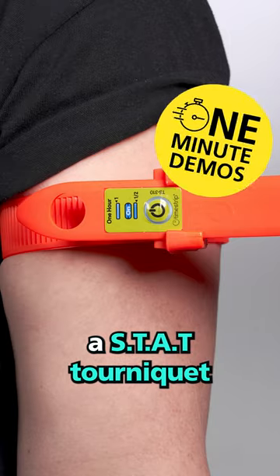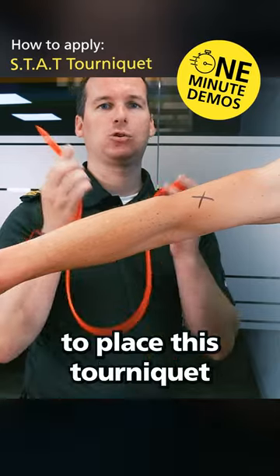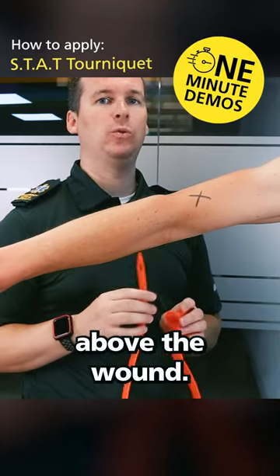This is how to apply a STAT tourniquet. If our wound was this X here, we're going to place this tourniquet about two or three inches above the wound.